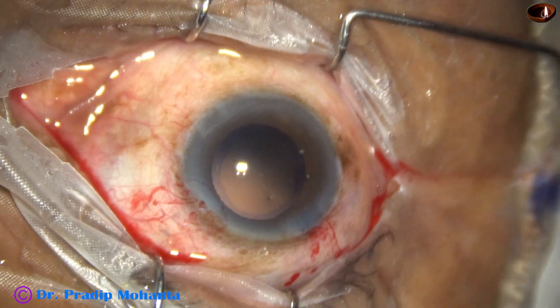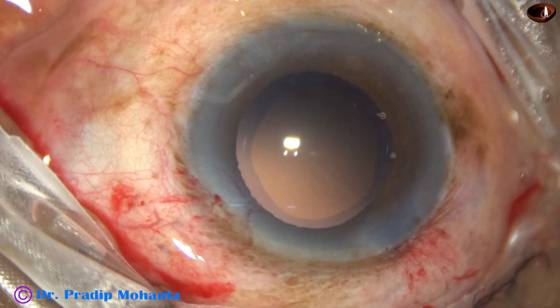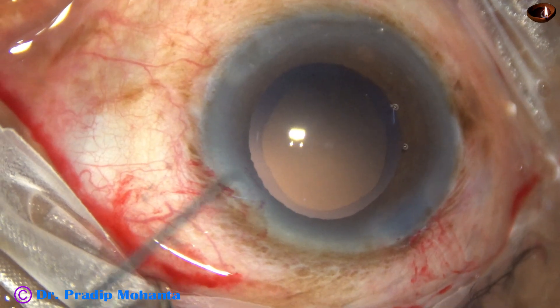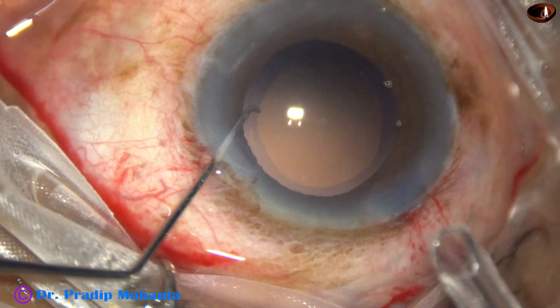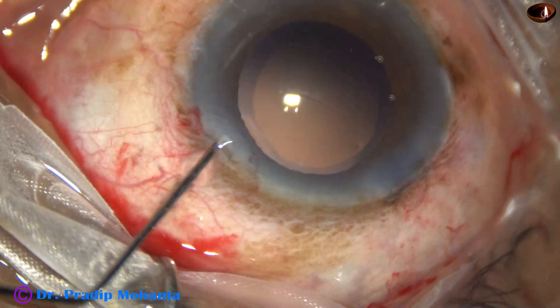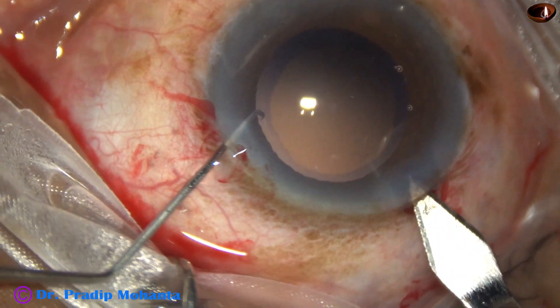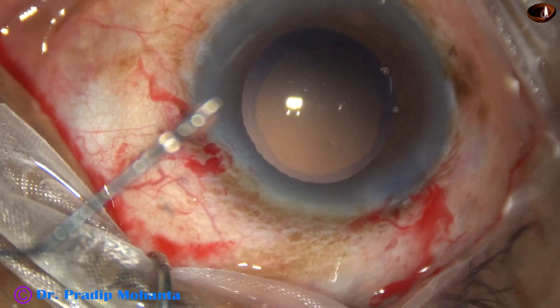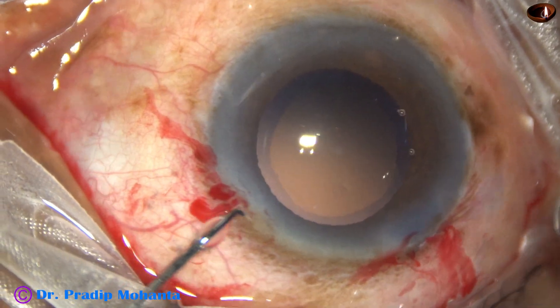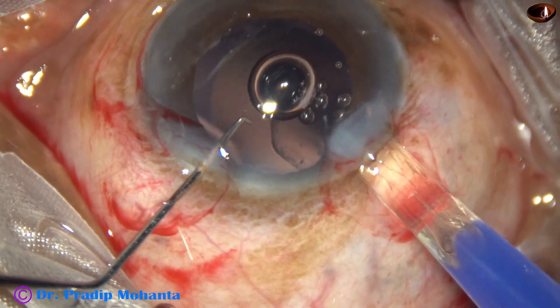It is placed on a disposable injector and here it goes. I tried to implant the lens without enlarging the main wound, but I find that I have to do wound-assisted delivery, which I usually do not like — because sometimes the wound gets stressed so much that fish-mouthing occurs and the wound may leak. So, better to enlarge the wound a bit and implant the lens.